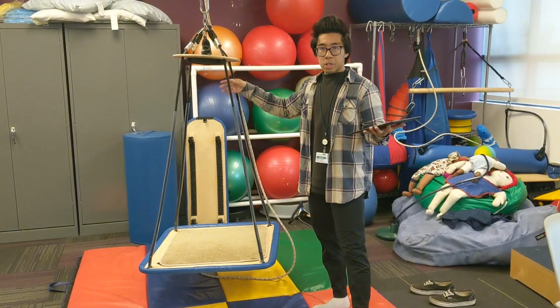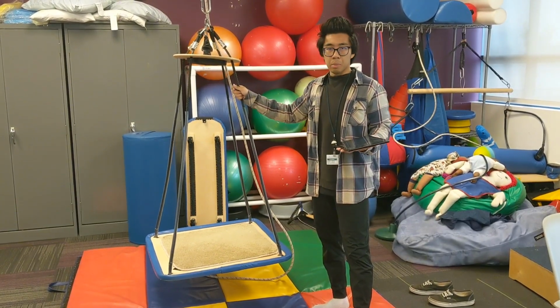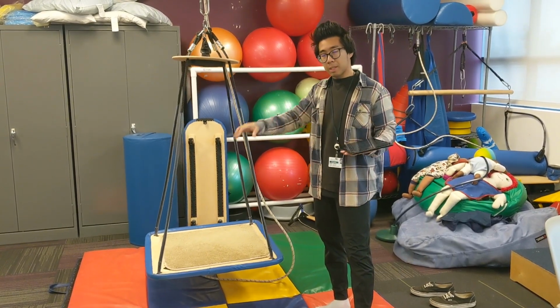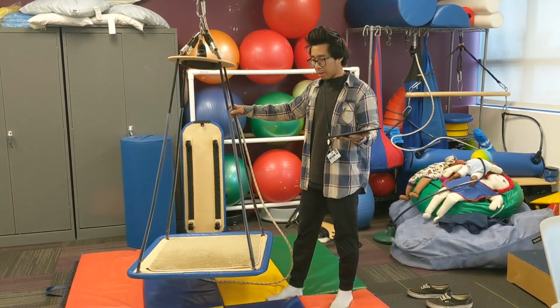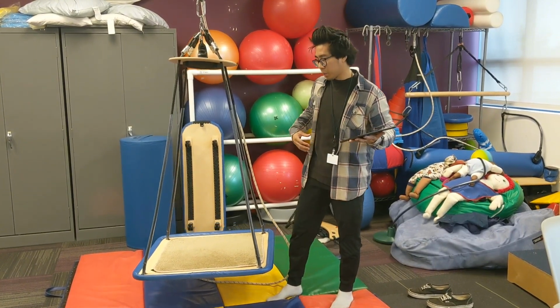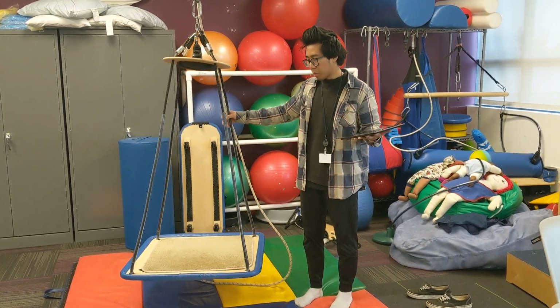Also, for swings in general, children work with motor planning, so you want them to problem solve on how to get on and get off, what body parts to move, what objects they could pick up, what sequences they could follow. This is a swing to work on your posture, especially those extensors when you are lying on your belly. It also helps with your obliques when you're sitting down. Also helps with eye-hand coordination and motor coordination.